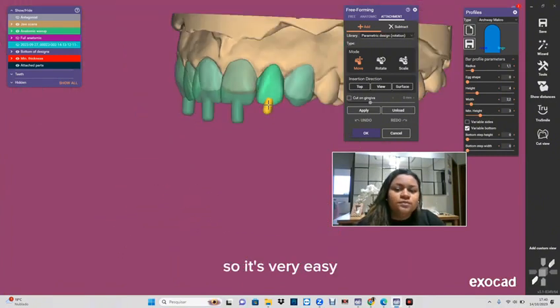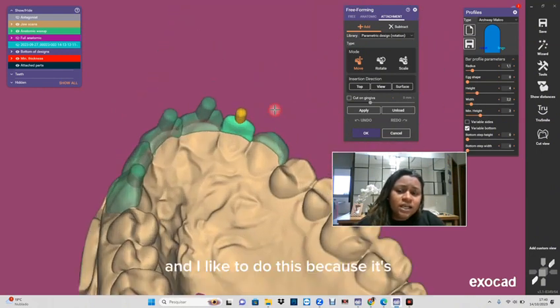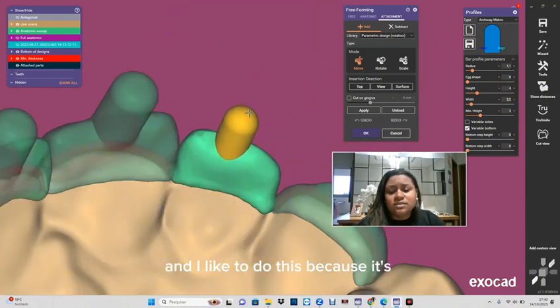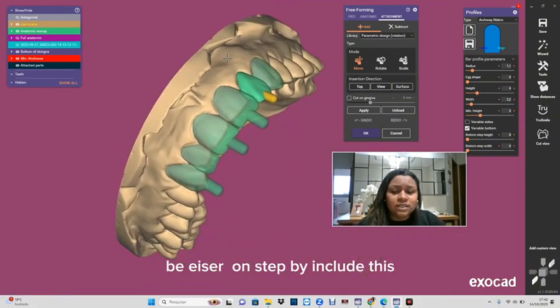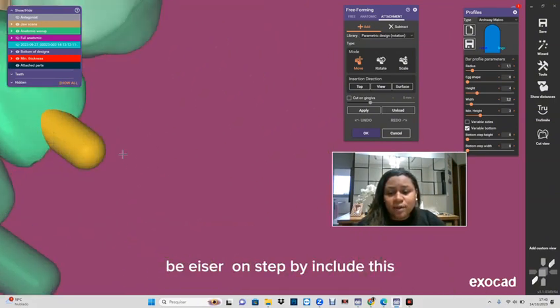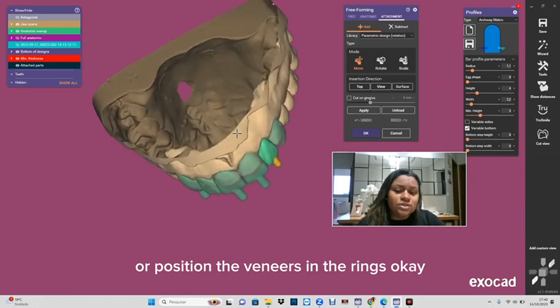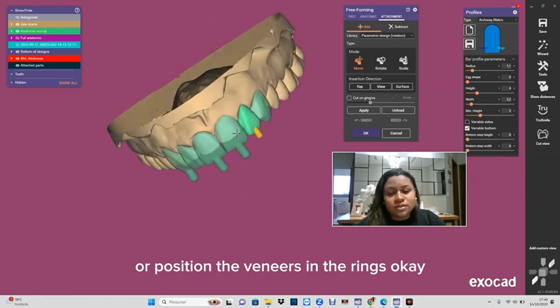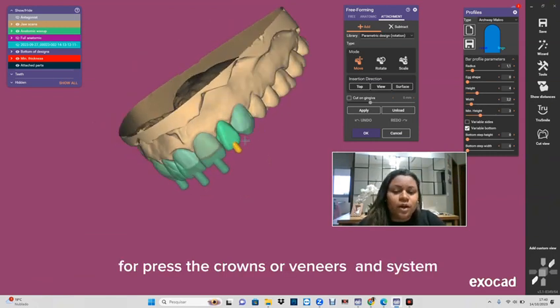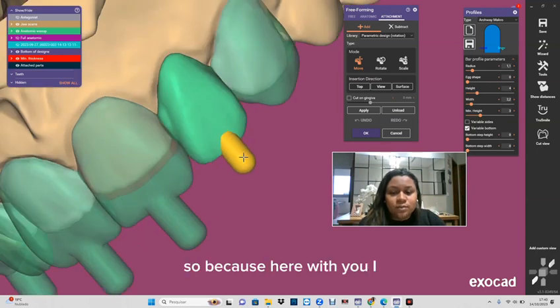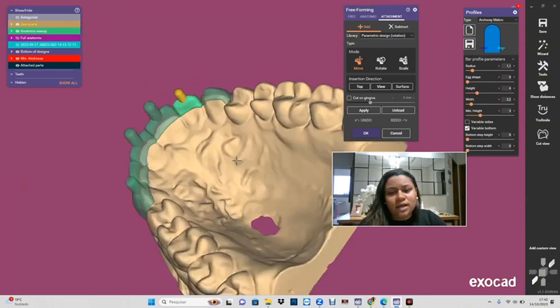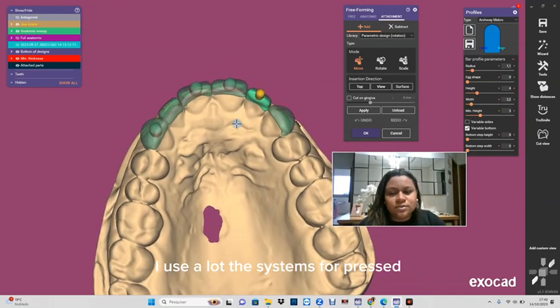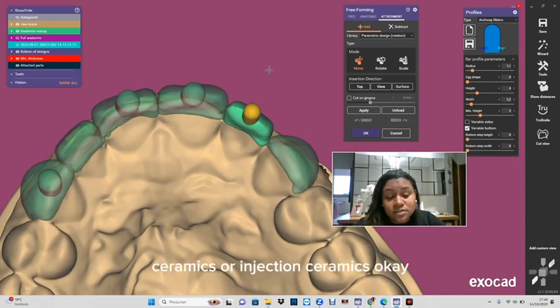And I like this because it makes it easier to position the veneers in the press system for pressing the crowns or veneers. Because here in Brazil I use a lot the systems of press ceramics or injected ceramics, okay.